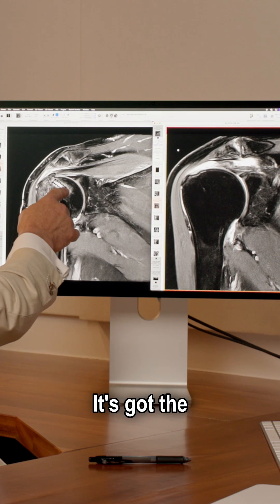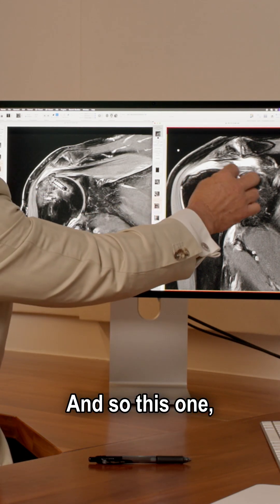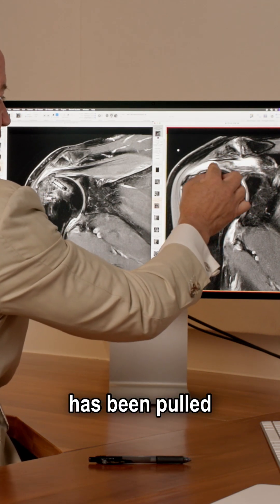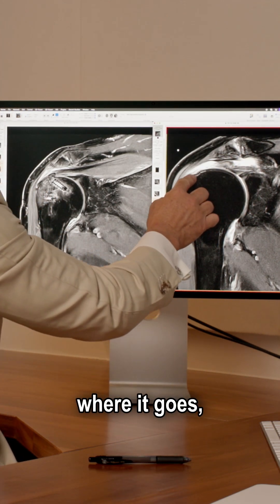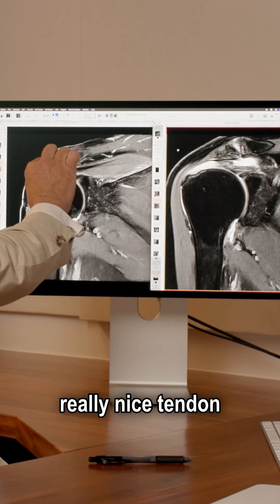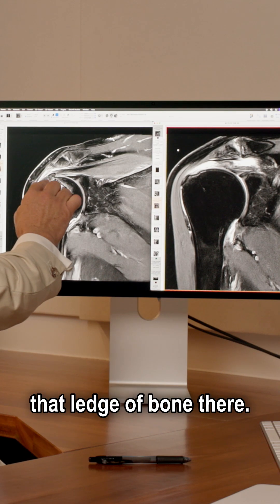See the tendon coming right across the top of the shoulder and joining onto that ledge of bone there? That's what we want to see. It's got the anchors in there. And so this tendon, which used to be curled up and crumpled here, has been pulled out, stretched out to length, and put back onto where it goes — onto that ledge of bone there. You can see this really nice tendon repair coming across and joining onto that ledge of bone. And that's what we want to see at six weeks post-op.